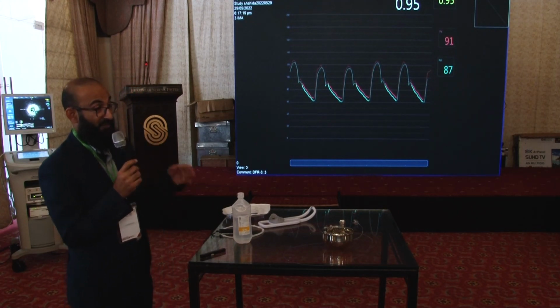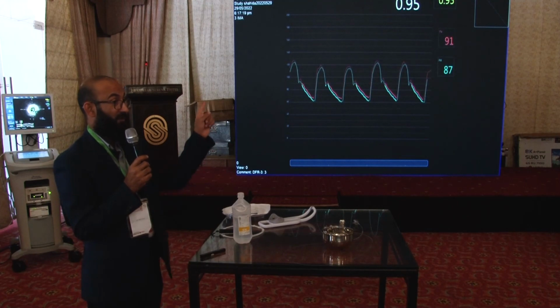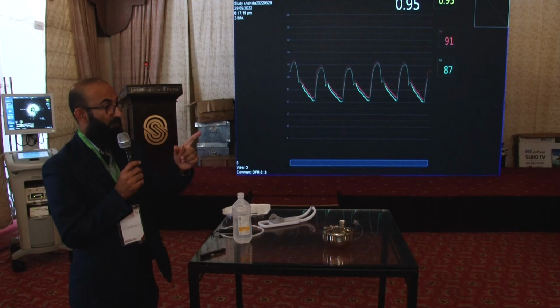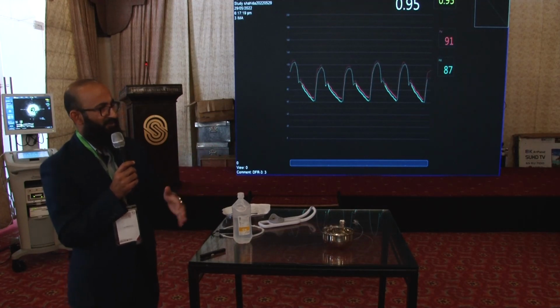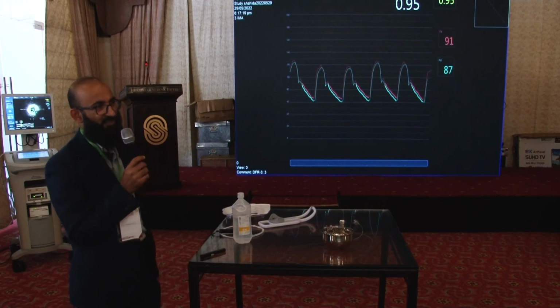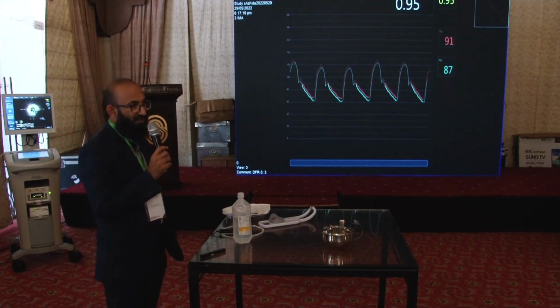But there is a lot of data from Japan and a couple of centers from Singapore. They are doing qFR, and it's very good. And it's very simple as well. It doesn't need anything; you do it on angiography. Yeah, that's the beauty. So there is data on it, but we don't have it. But we are looking for it. Maybe in future we can have that.